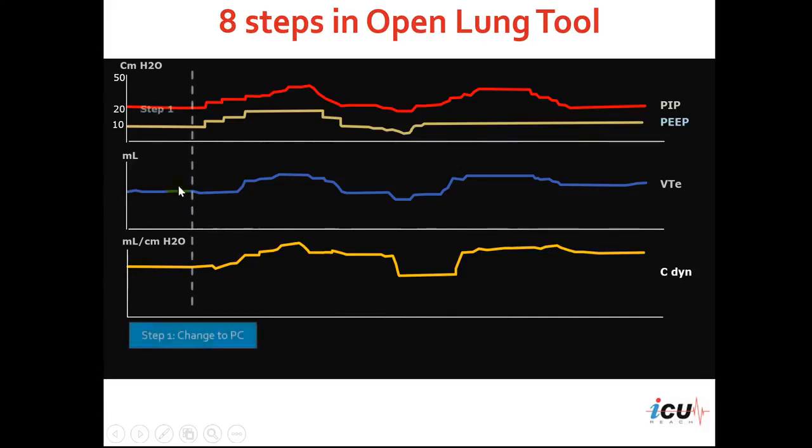The first step is to change to pressure control mode of ventilation. You can see that this patient is on PEEP of 10 with a pressure control of 10, giving a peak inspiratory pressure of 20. This is the expiratory tidal volume and the dynamic compliance of the respiratory system.